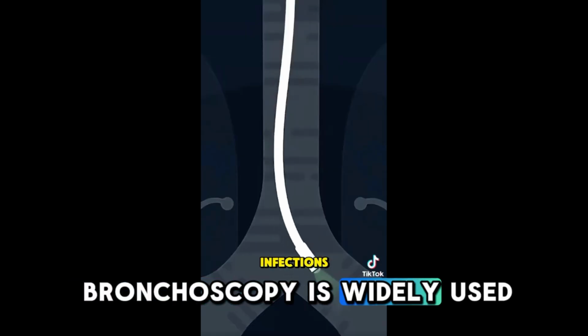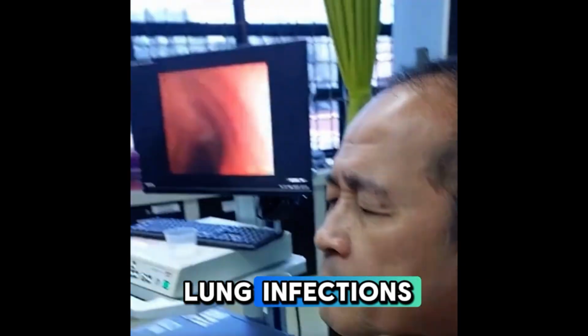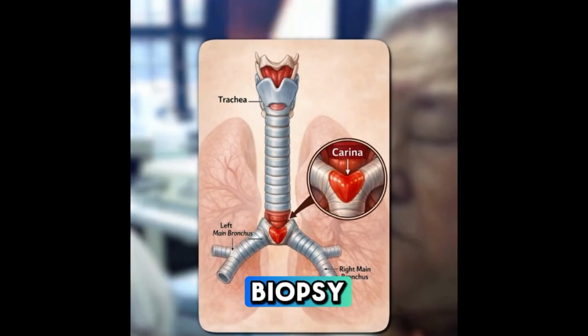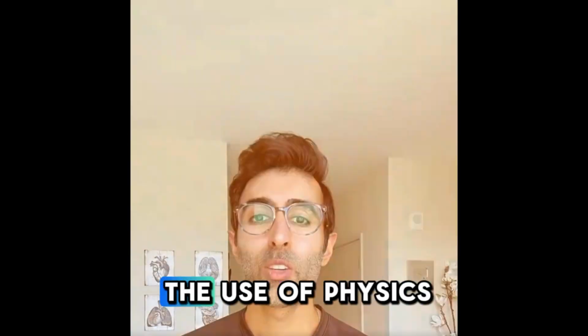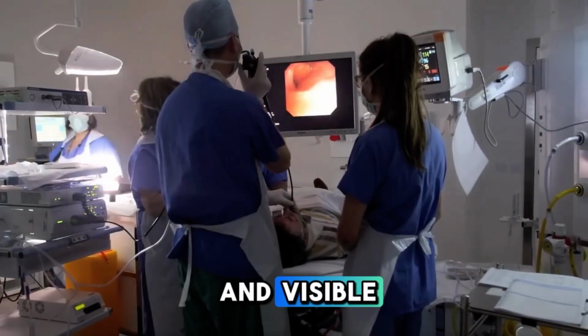Bronchoscopy is widely used in hospitals for several important purposes. It helps doctors diagnose lung infections, detect tumors or cancer, remove foreign objects, and take tissue samples for biopsy. All of these applications are made possible through the use of physics. Wave optics ensures that images inside the lungs are clear and visible.